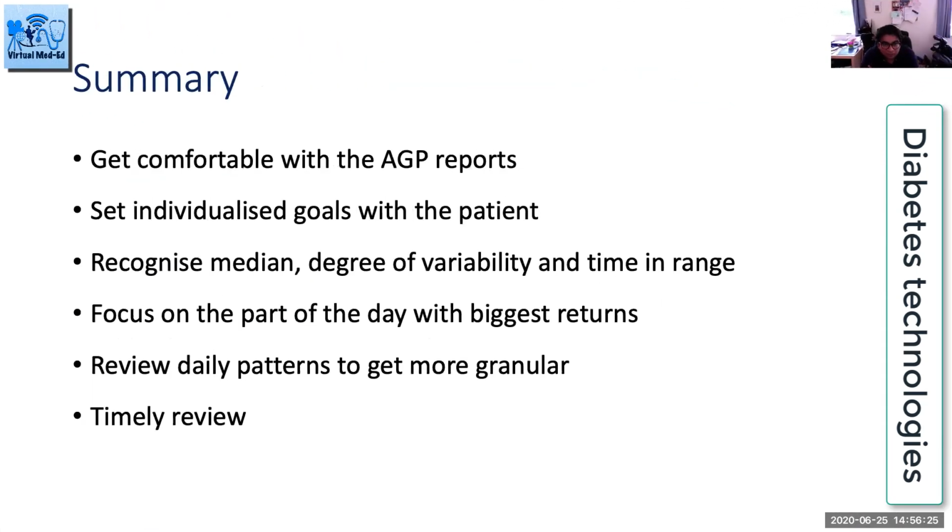So in summary, I think we need to get very comfortable with AGP reports. It is incumbent upon us as specialists in this area to understand what it is, how to explain it to our patient in a non-jargon way, but more importantly, to show leadership for diabetes specialist nurses, so that when they see the patient, because they spend more time with the patient than we do, they know what they're doing.